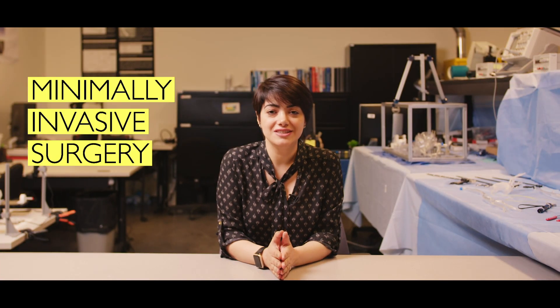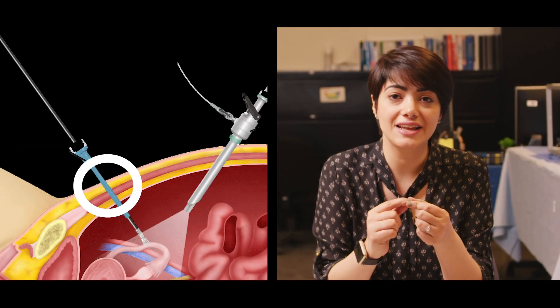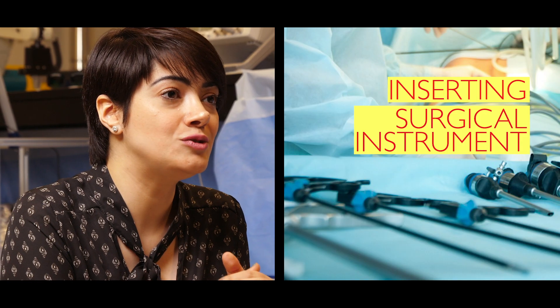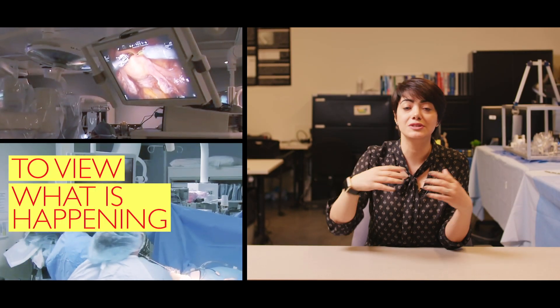During minimally invasive surgery, surgeons make a small incision with the length of a fingernail and insert surgical instruments into the patient's body. In addition, they insert a camera to have a vision on the surgery during the procedure.